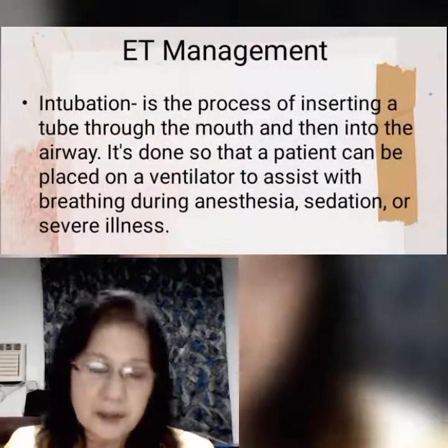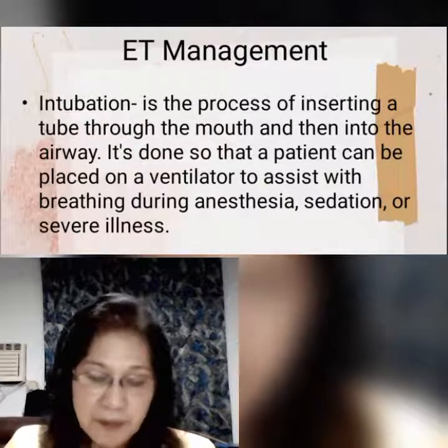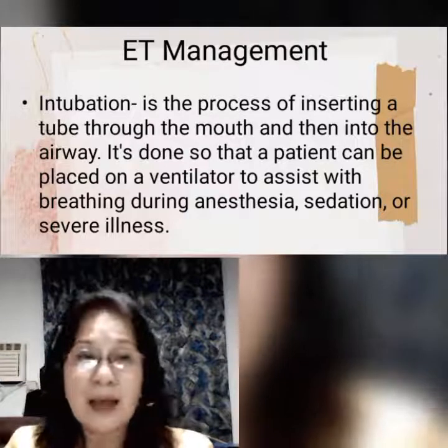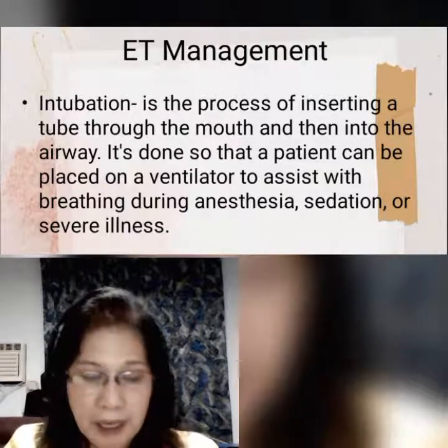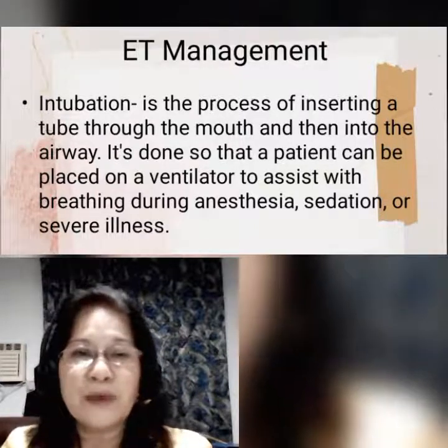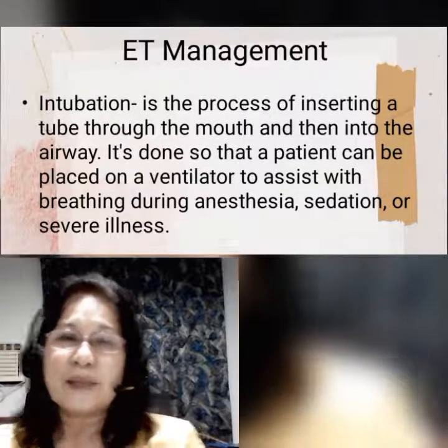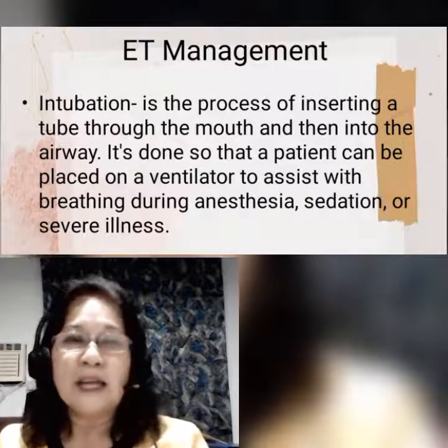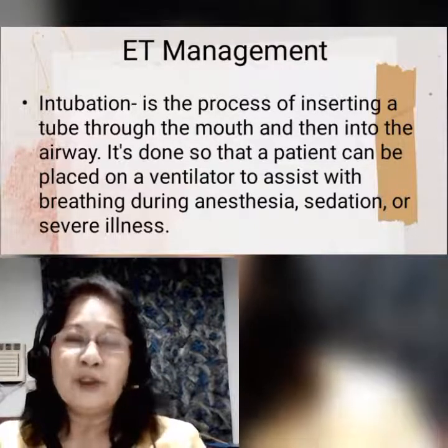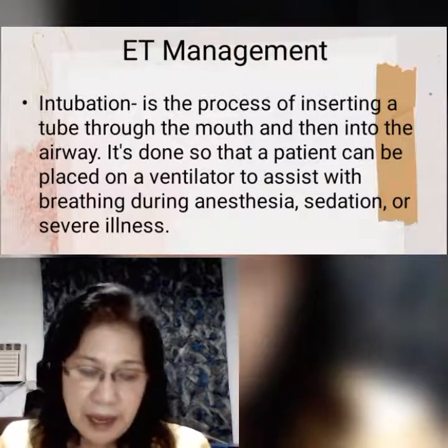Then I'm going to introduce to you the ET management. What is ET management? This is your endotracheal tube management. Now, there are so many purposes of intubation. The number one is opening up the airway to give oxygen. Intubation is the process of inserting a tube through the mouth and then into the airway. It is done so that the patients can be placed on a ventilator to assist with breathing during anesthesia, sedation, or severe illness. Okay?